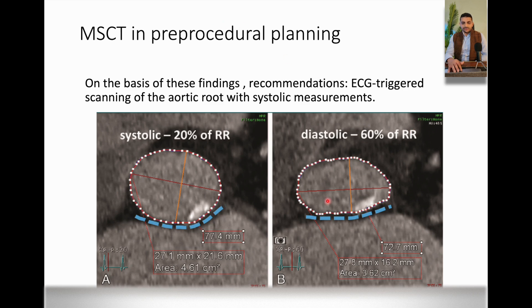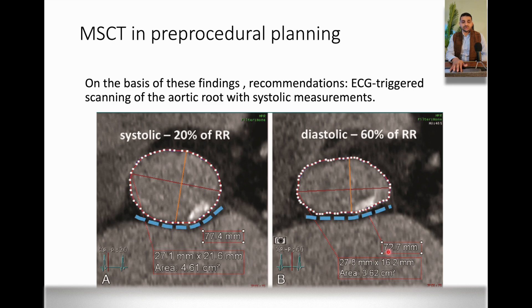This is proven by the image shown here — the same patient with the same calcifications. The systolic phase is from 0 to 40%, triggered at 20% of the RR interval. The diastolic phase is from 40 to 100%, here at 60% of the RR interval. The perimeter measured in systole is 77.4 millimeters, while in diastole it is 72 millimeters. This proves that the annulus measurement in systole is bigger than in diastole, which is why we measure in systole.